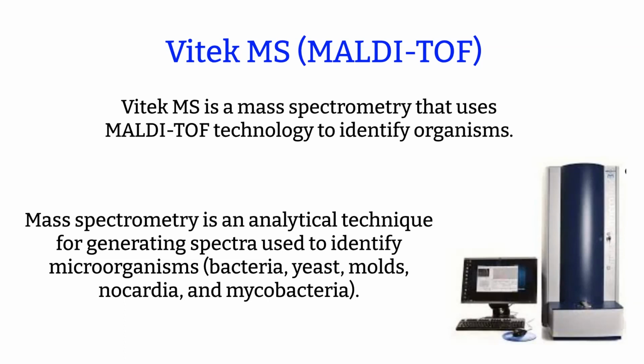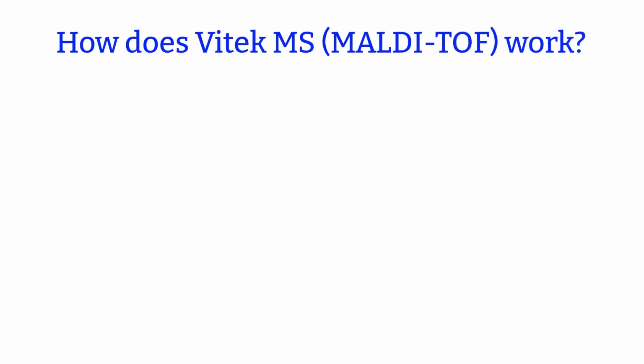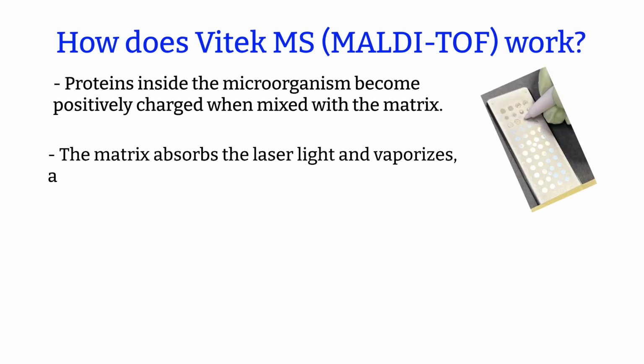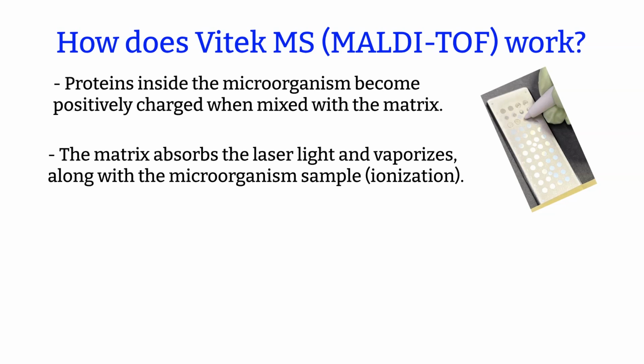MALDI-TOF technology involves mixing a microorganism culture with a matrix, which absorbs energy from the Vitek MS laser and transfers it into the microorganisms to enable ionization. How does this work? Proteins inside the organisms become positively charged when mixed with the matrix. The matrix absorbs the laser and vaporizes along with the microorganisms' ions.